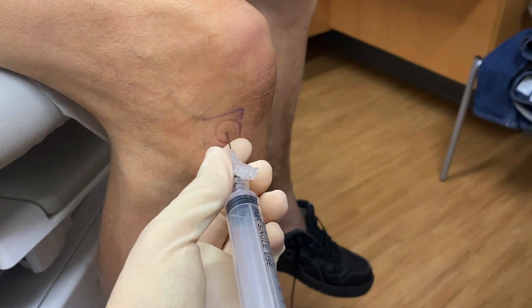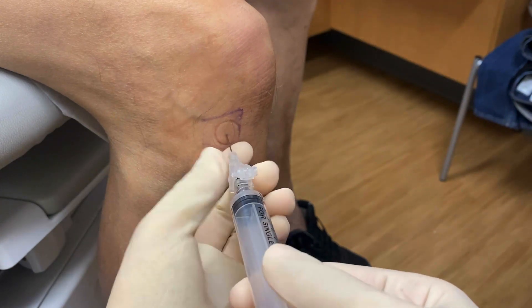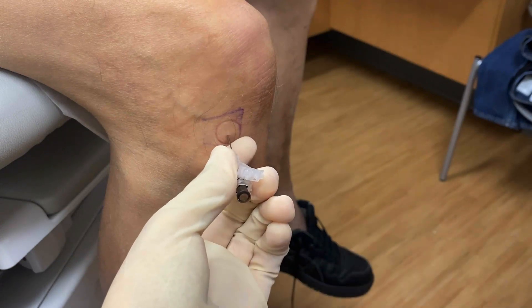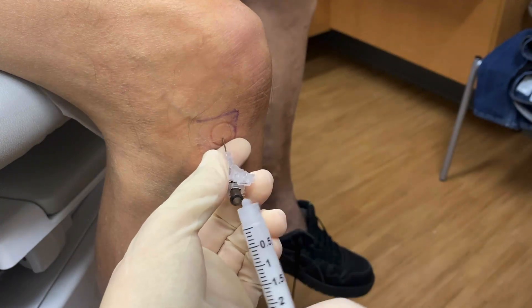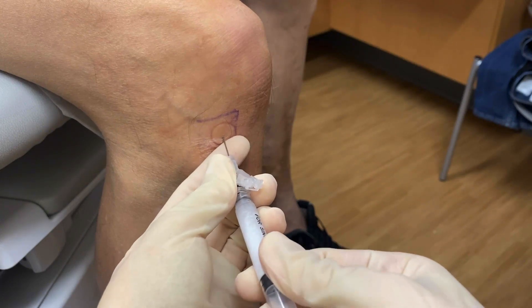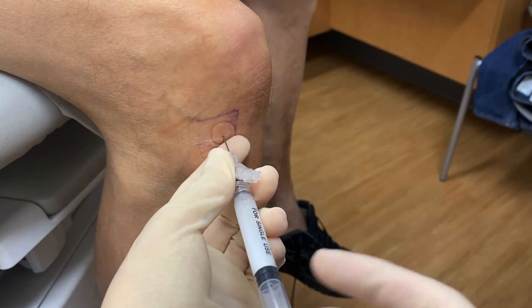Then, if you're planning on injecting the knee joint, grip the needle with either your gloved hand or with the forceps. Twist off the aspiration syringe and attach the smaller steroid syringe. Briefly pull back on your plunger once again to ensure you're still in the joint space.